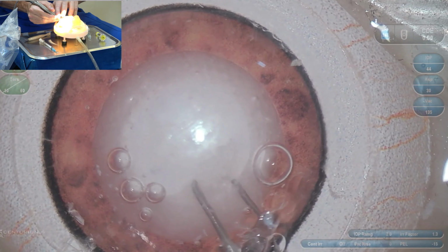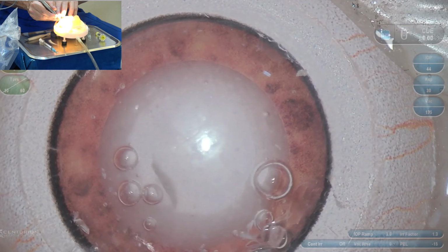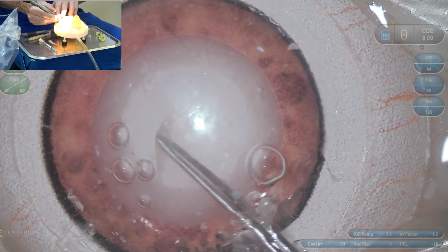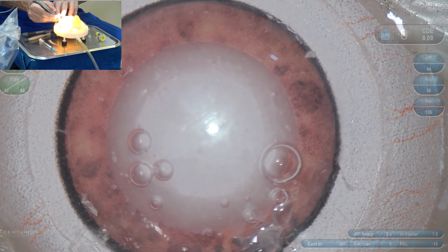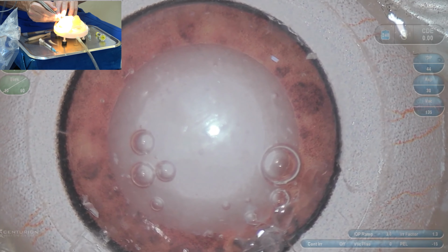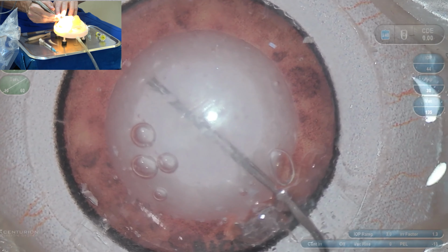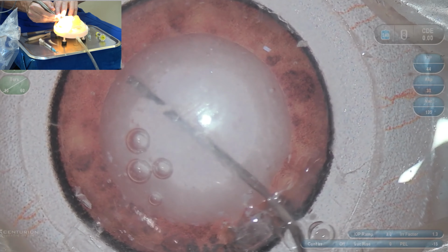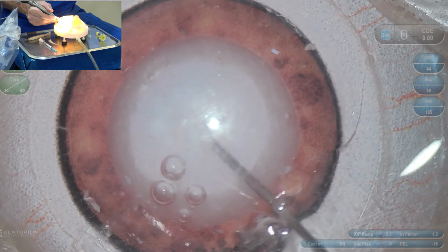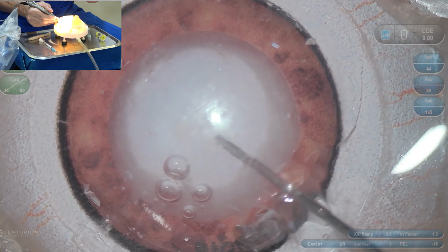It needs to have the correct width and the correct depth. Look at that. We are seeing a little bit of the red reflex coming, so we can infer that we have a correct depth. Can you see it? Amazing. So this model is going to be good for you to talk about that trench. And now with the second instrument, we're going to do the cracking maneuver. As we said, in this step the important thing is ultrasound.